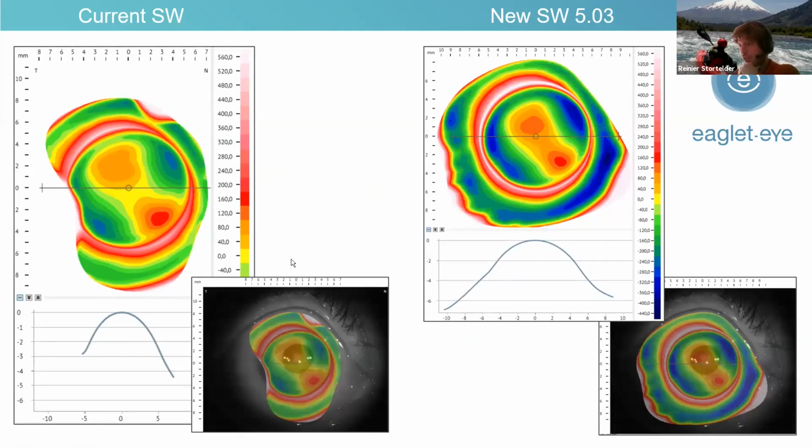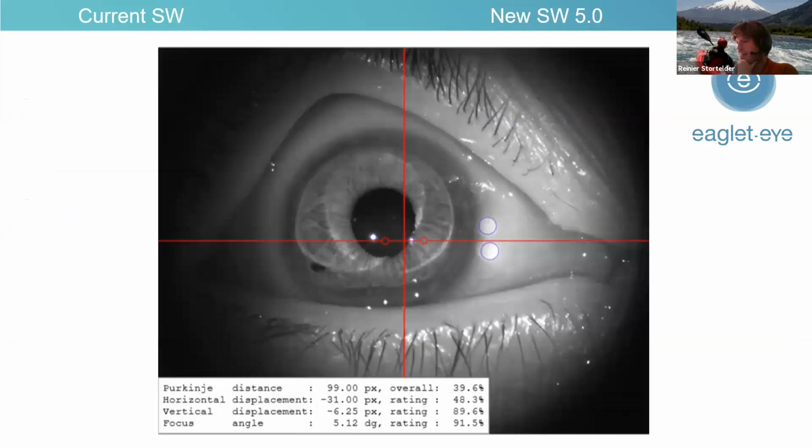One more example. Here we notice again that it is breaking on the cornea due to very strange sharp edges. The new algorithm can handle it much better, and here we have a measurement that is almost 10 by 10 millimeters, and also vertical, just limited by the eyelids. Just the last example to show.